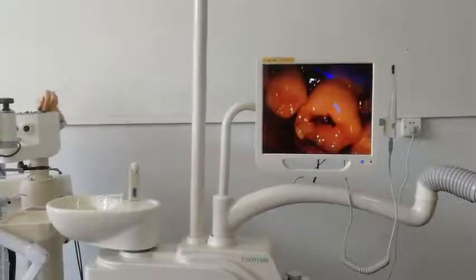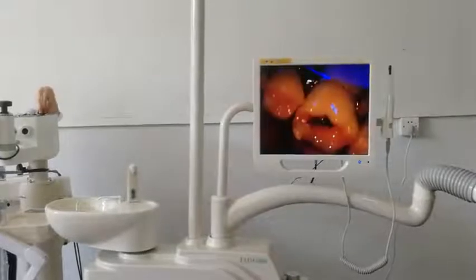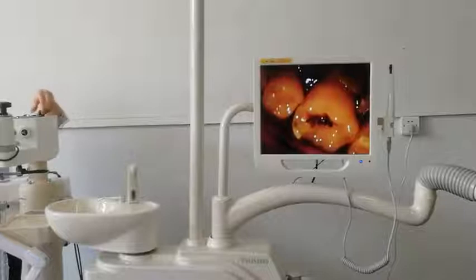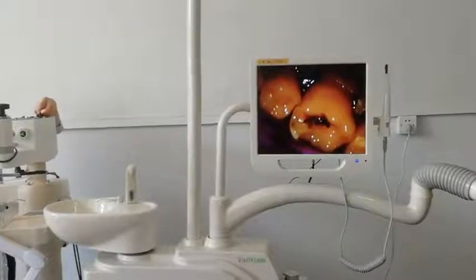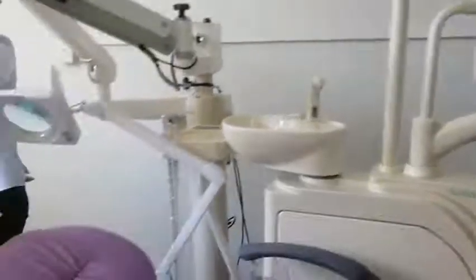We will see. Now it's turned off and we will turn on. Here is the lower mode, normal mode, and high mode. And this is our microscope.